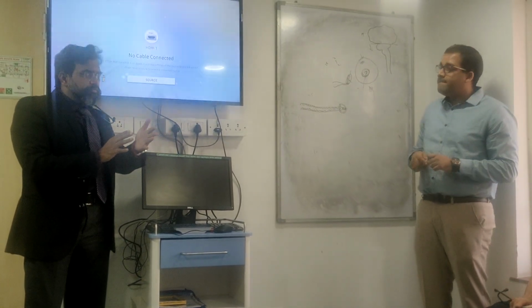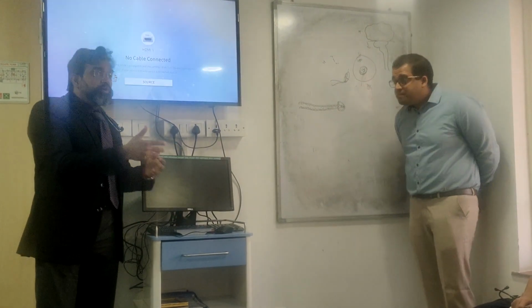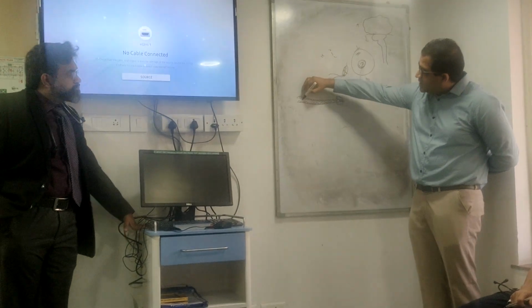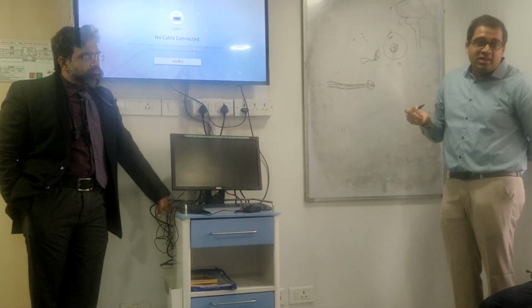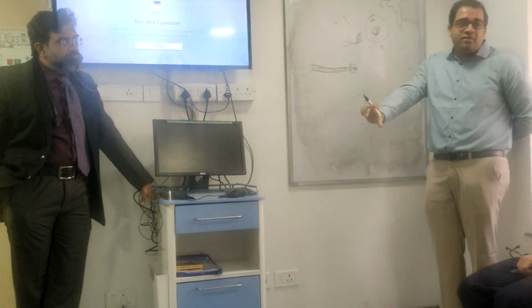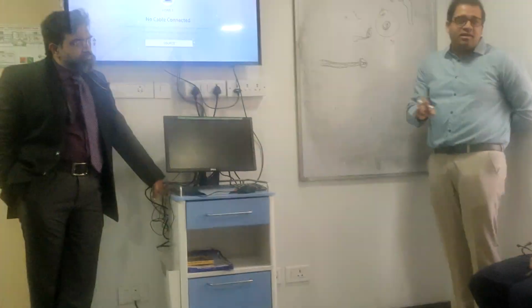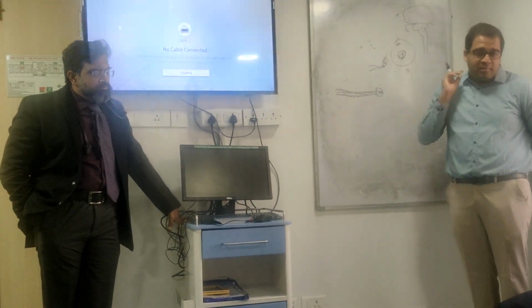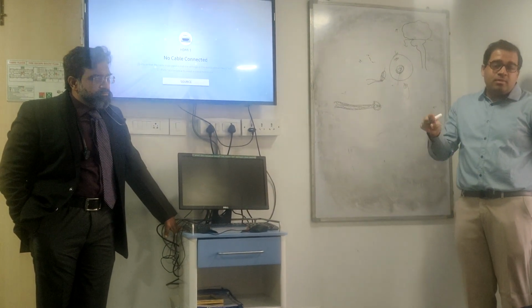But what happens, for the audience, if the central line grows and the peripheral doesn't grow, and when do you consider that to be important? When a central line grows, basically this has grown, whatever is inside, because you're collecting blood from the line. So you know for sure there's a biofilm. That is established, if your sample technique and line handling are proper, excluding contamination. Now in a peripheral blood, there are so many caveats.